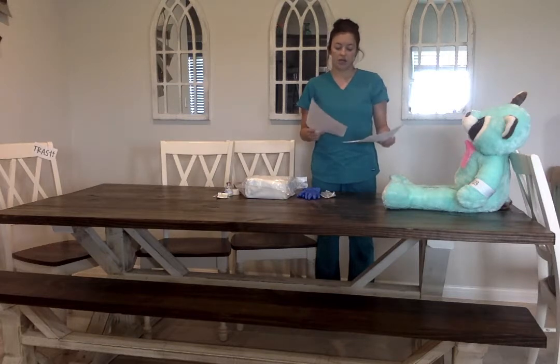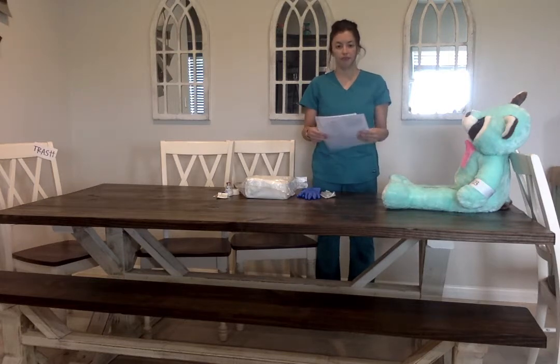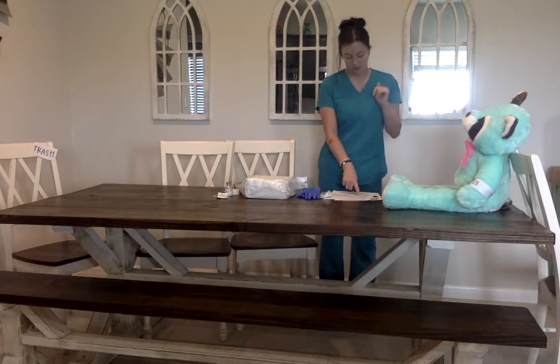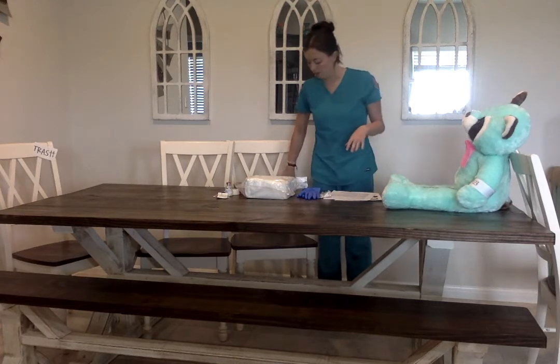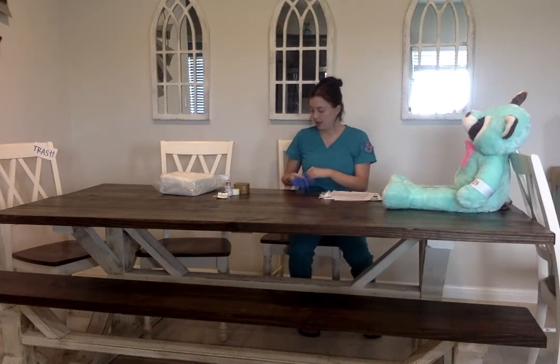So I'm just going to give him the heparin 5,000 units, which is 1 milliliter. Since it's sub-Q, I'm doing it in the outer aspect of his upper arm. But I'm going to go ahead and prepare the medications. I have washed my hands and I put gloves on.